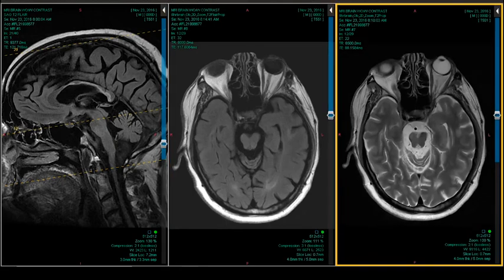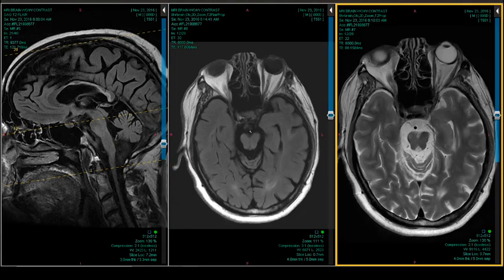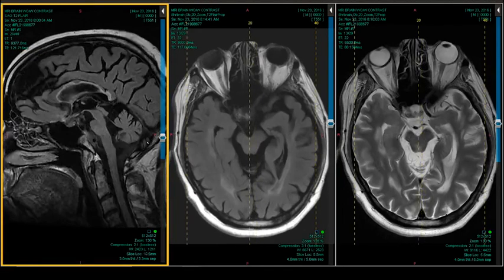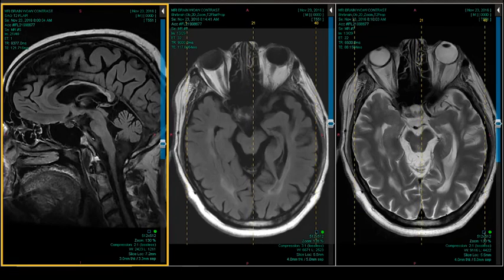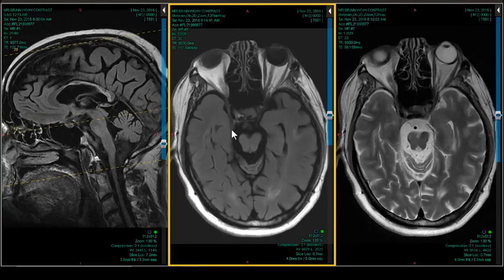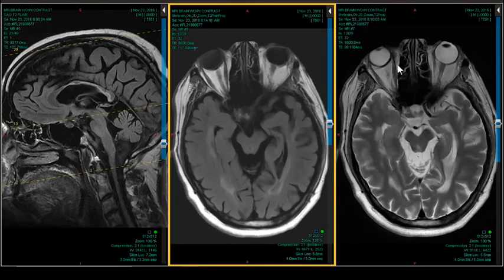And I've got an axial T2. I'll scroll these together. I'm not going to go too far off the midline on the sagittal. This is pulsation anteriorly for those of you that are wondering, and hopefully you're scrolling your own. This is a very complicated case, so take a little bit of time, and I would look at all the images. Make sure you look at the coronal.